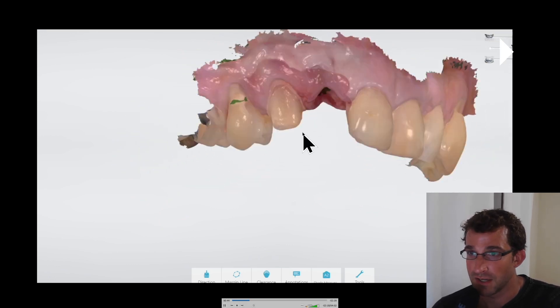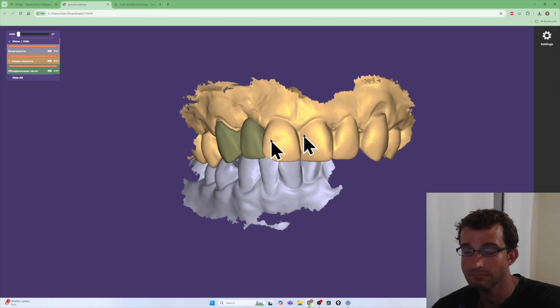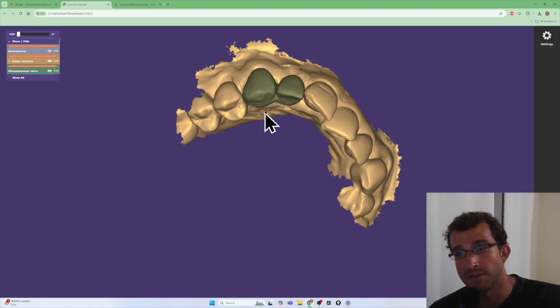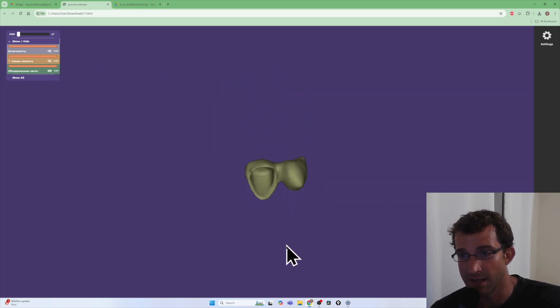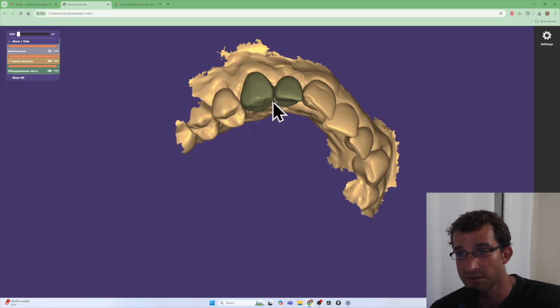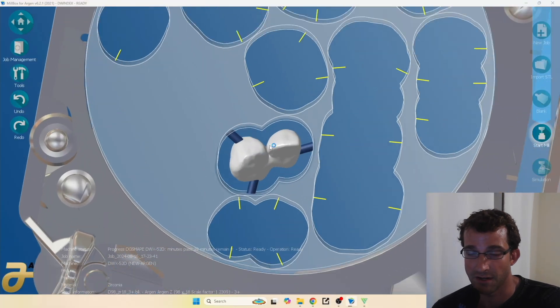There was a good 1 to 1.5 millimeters of clearance at its thinnest point — there's the clearance map — so lots of clearance for structural durability. There's the unit in Exocad, and this is going to have lots of strength. The canine has lots of root anchorage, so it's not asking too much of the canine tooth. It's just a nice, quick, and easy solution for a case like this.